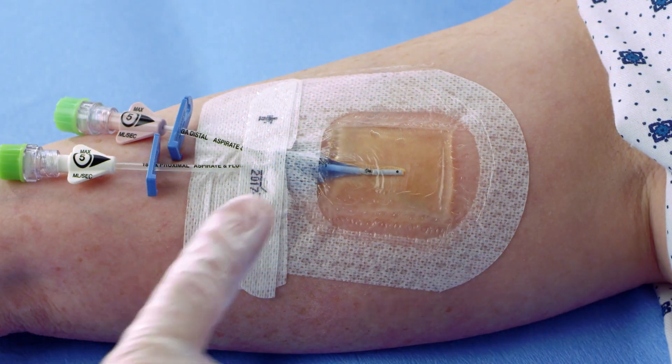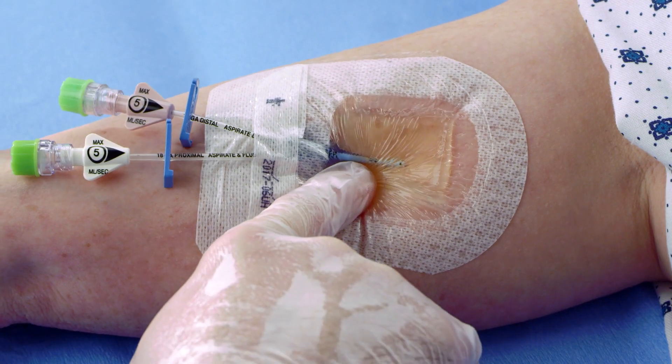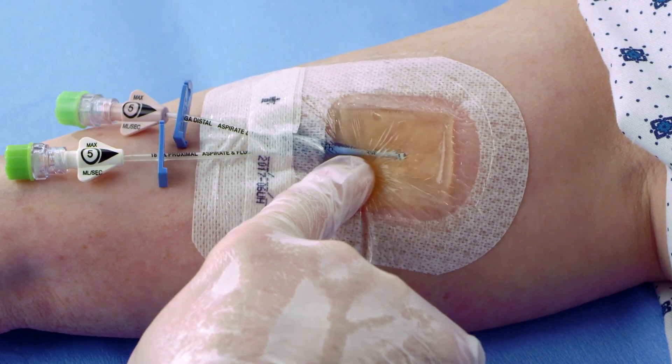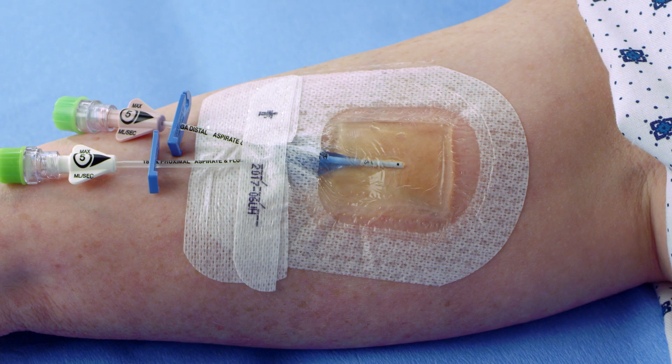To properly monitor the gel pad, test the saturation of the dressing by lightly pressing down on the gel pad corner with your finger. When you remove your finger, if the gel pad remains displaced, the dressing should be changed.